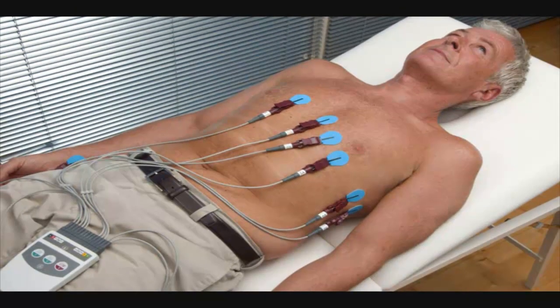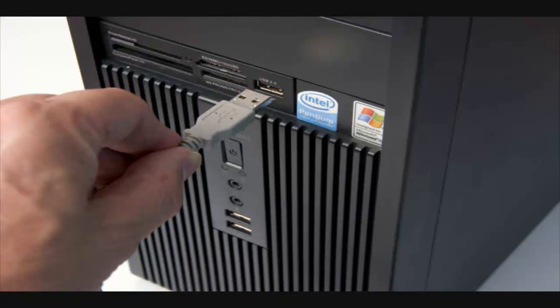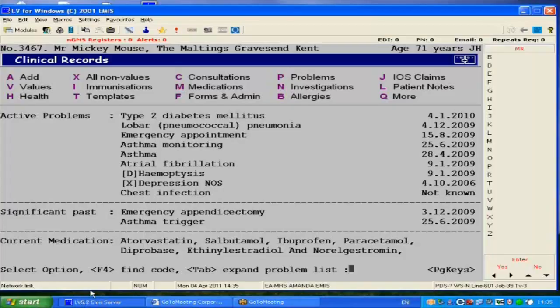Once all the electrodes are secure, it's time to begin the monitoring of the ECG. Make sure the ECG cable is plugged into the USB port of the computer.